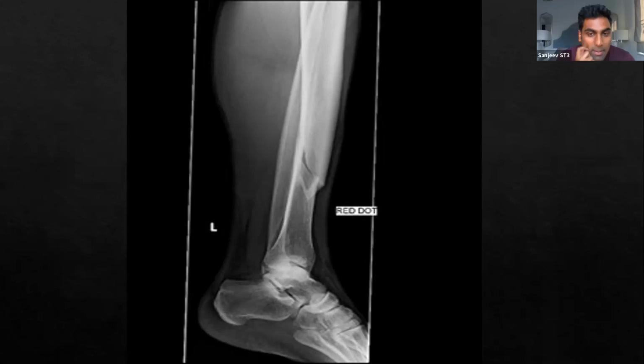Absolutely, yeah. So make sure you remember to say that, because I think if this does come up in the OSCE, it is very potentially another tick mark. But very, very good presentation, Alex. You absolutely were right. You spotted the fracture.